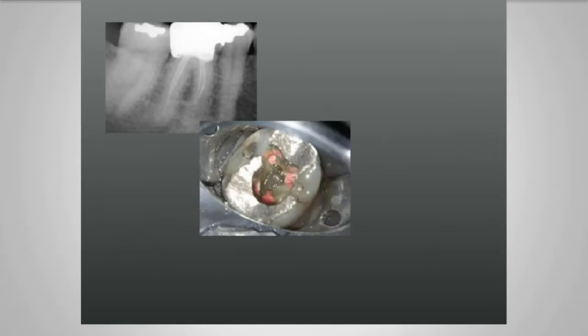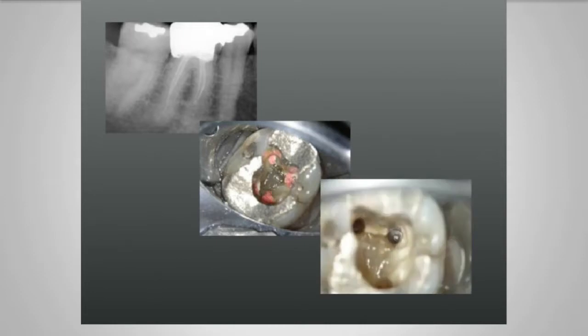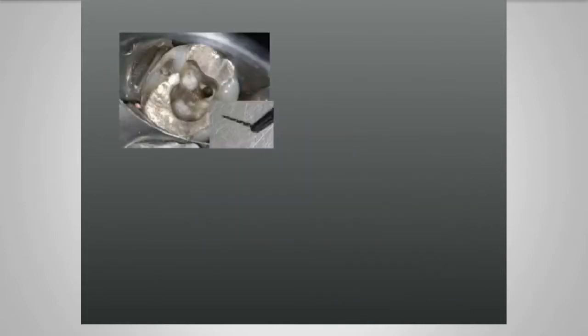That's the gutta-percha root filling in the root canals. You can see I've made myself generous access through the amalgam restoration because I need space in order to retrieve the instrument. And now I've used the modified Gates-Glidden burr number 2 to cut down to the head of the instrument, and this is the head of that instrument here, looking down there with the microscope. And now I can use a modified Endosonic file to gently apply ultrasound around the edges of that broken instrument, and here we are, this is it removed.